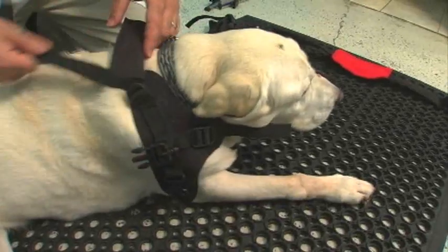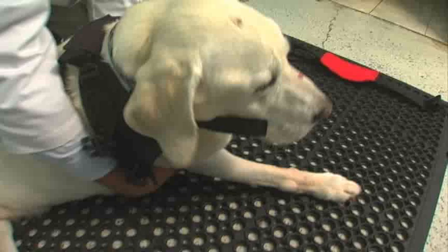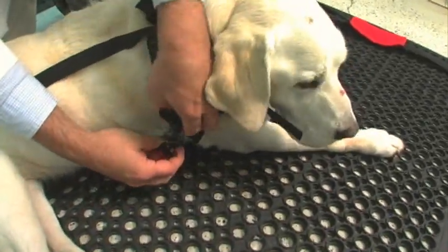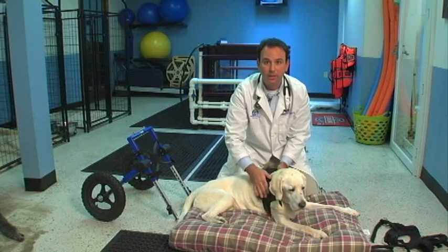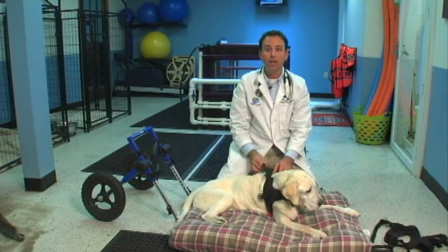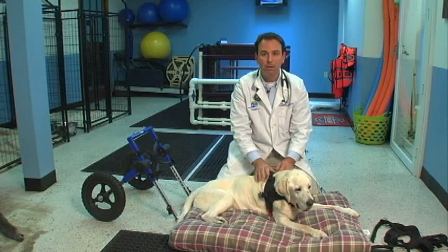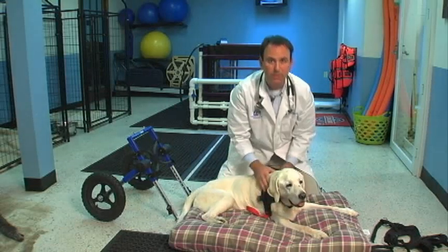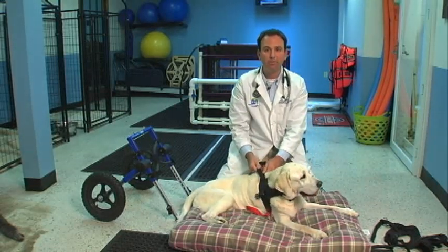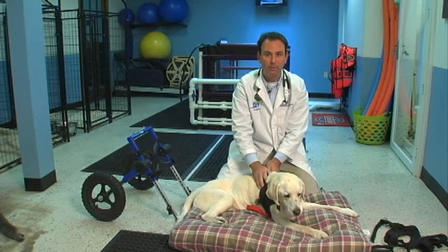So we're going to unclip the red clip, and we're going to slip this over Sonny's head like this. And then we're going to take the red strap and loop it underneath Sonny's body. It's really important that these side panels are right on the shoulder blades like I have them on Sonny. Another key point is that you need to have the top strap pretty tight and secure. It's not so important with the bottom red strap, but the top strap is where a lot of the stability for the cart comes from. So we want to make sure that it is nice and secure up on his shoulder blades.